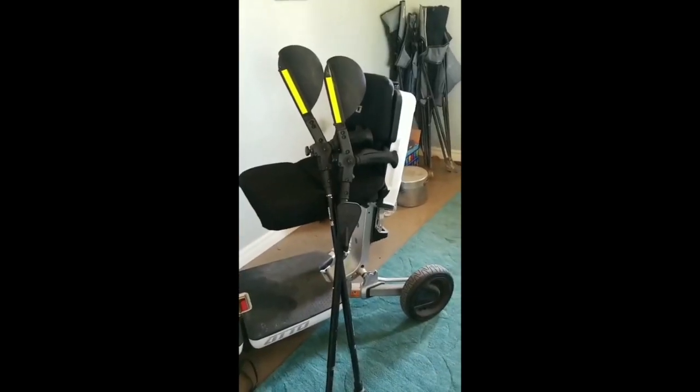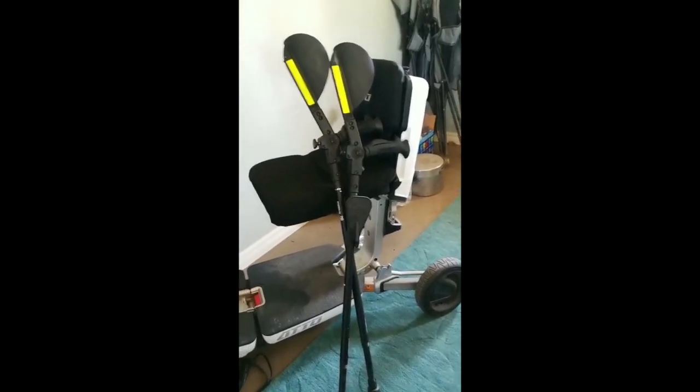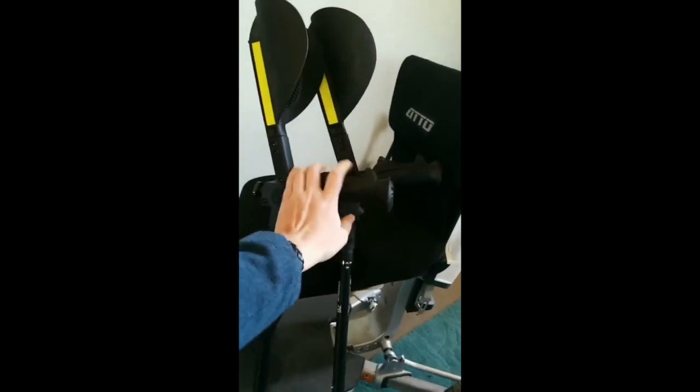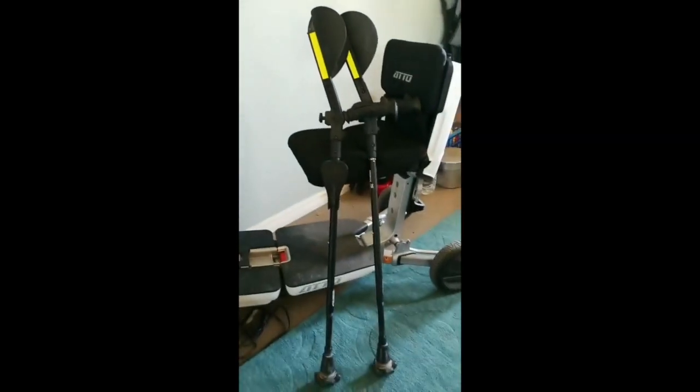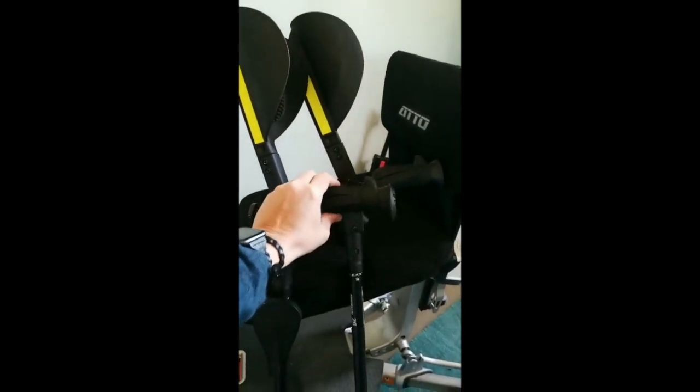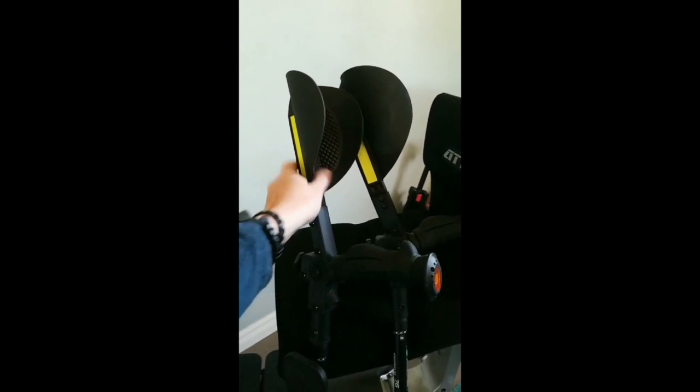And lastly, I have my crutches. So these are forearm crutches. So basically you want to have your arm in it, and that is your main source of support. So it's very different than the armpit crutches that most people see. These are great because they are ergonomic, so they don't hurt your hands and they're kind of squishy. Same with this part that has some cushion on it for your arm.